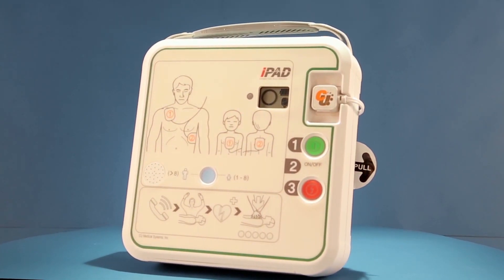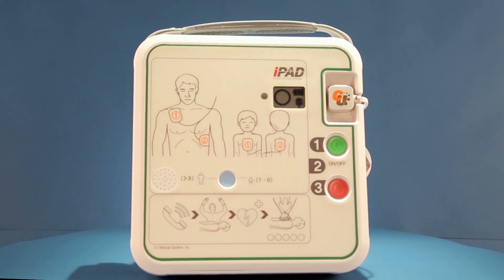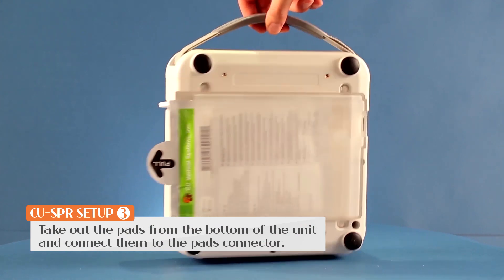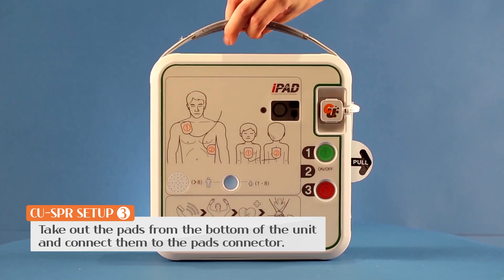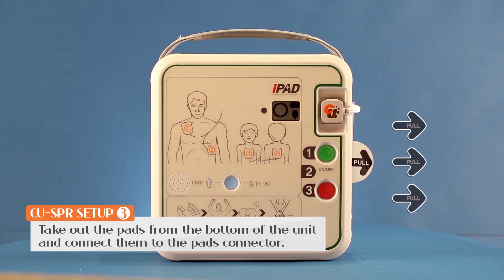After the mode is set, two pad attachment indicators will turn on. Take out the pads from the bottom of the unit and attach them correctly. Attaching the pads will activate the CPR voice guidance.